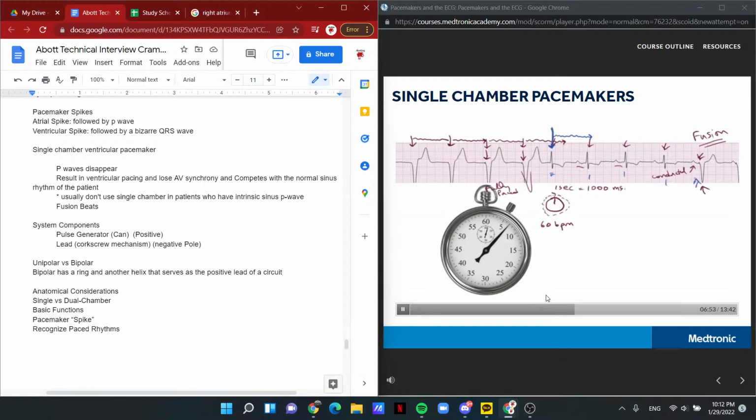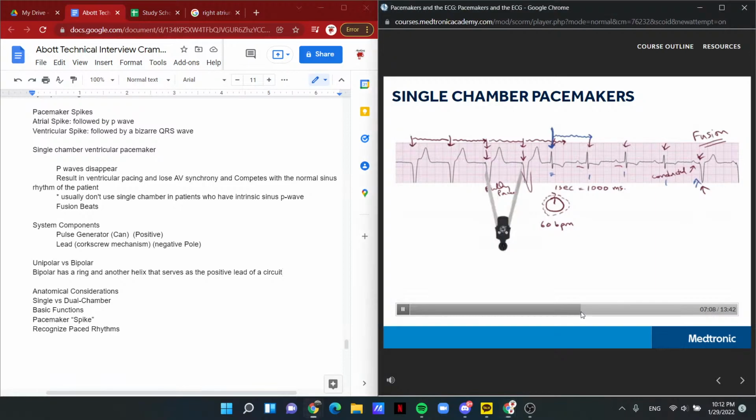It's very useful to use a pair of calipers in analyzing the paced heart to show you at what moment the clock started. Since we know the clock is running at this interval, if we place the calipers on this spike and measure back, we can see that the pacemaker actually put a spike out at this moment. The spike is hard to see there, but this is a problem with ECG machines trying to pick up tiny pacemaker complexes.